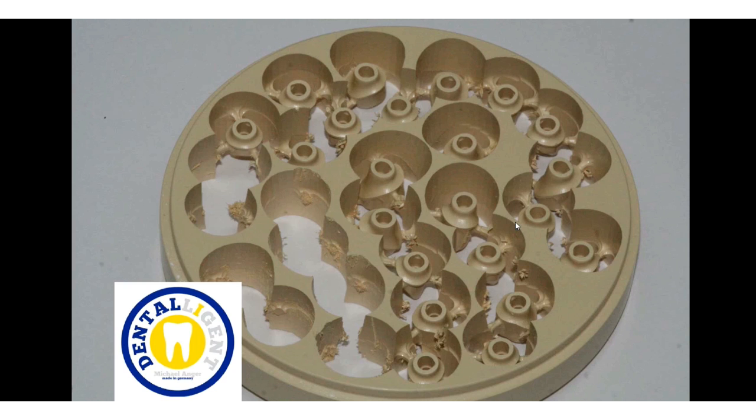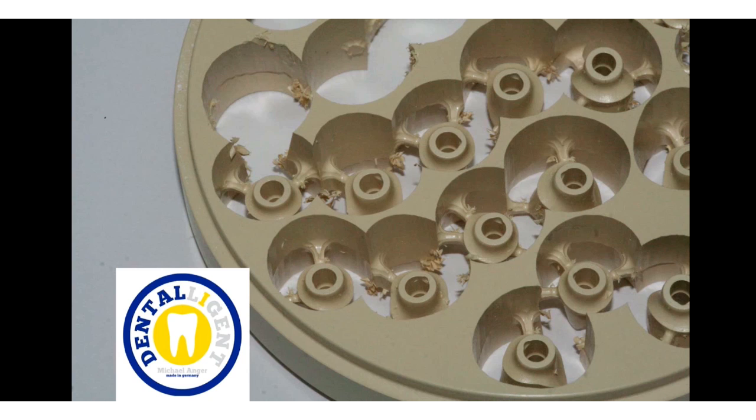It is a tooth-colored PEEK with extremely favorable physical characteristics. As you can see very well, this material is excellent to mill and forms, in comparison with other PEEKs, only little shavings on the router to legend objects.